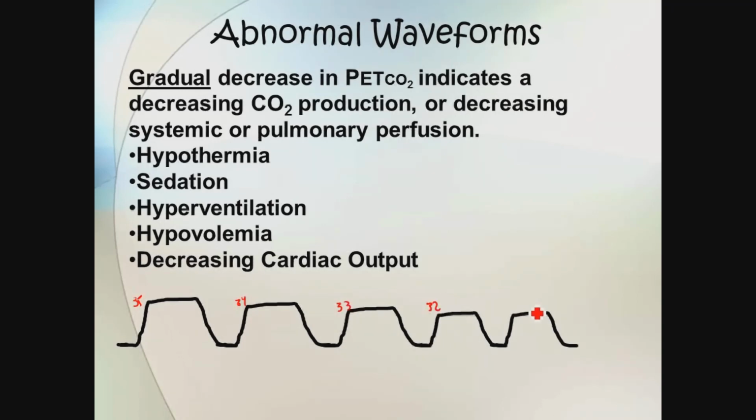and it's just going down on a much, much slower basis. And this is basically something where, again, it could be perfusion being reduced. It could also be just that the CO2 production is reduced. So we'll see this in the OR when they start cooling them down. You start having metabolic rates slowing. You're going to have less CO2 being created, less CO2 being exhaled.